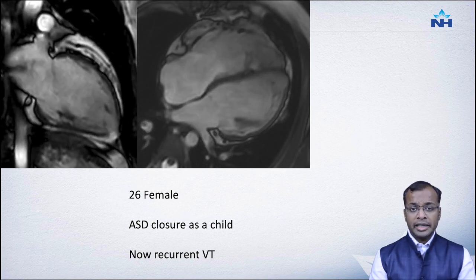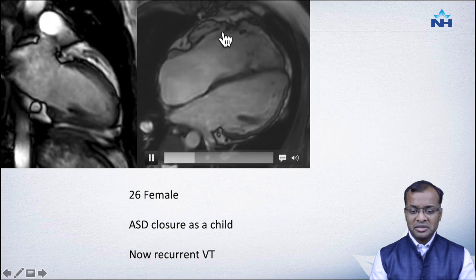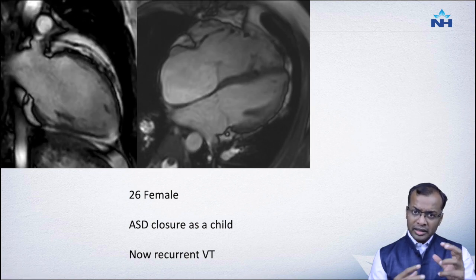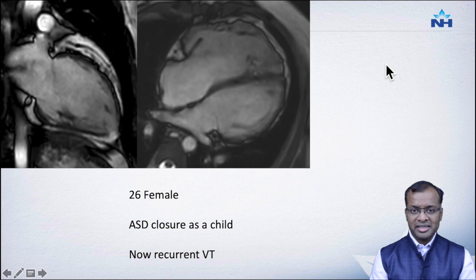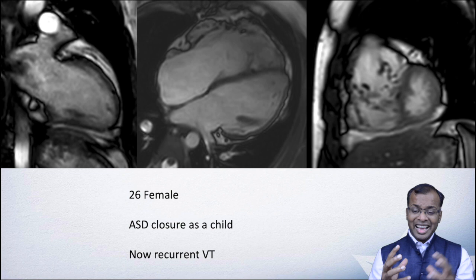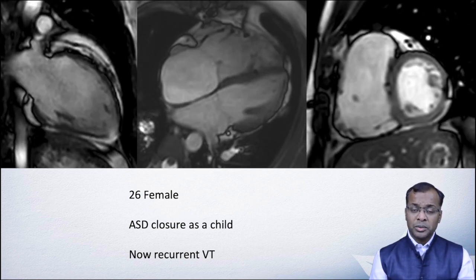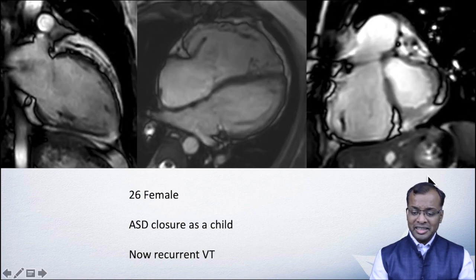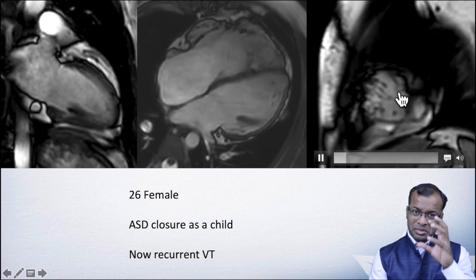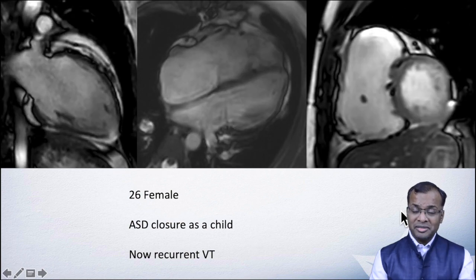Now, look at the cardiac MR closely. When we look at the RV free wall, you start to see these areas of dyskinesis. Things are not contracting as well as one would like them. The LV and RV are also very dysynchronous in their contractions. We do the short axis images and you can see that the RV is grossly dilated and it's just not contracting as well as what one would expect. You can see the inferior wall is not contracting well, and again the lateral wall has these microaneurysms that one can see. This again is suggestive of ARVC.